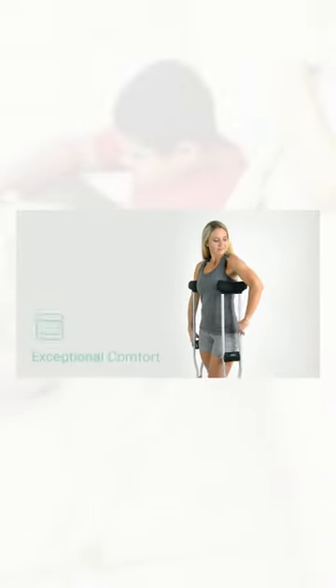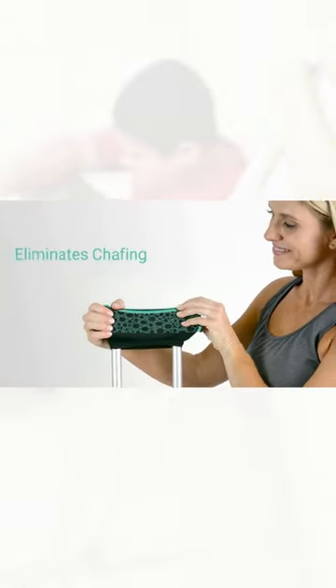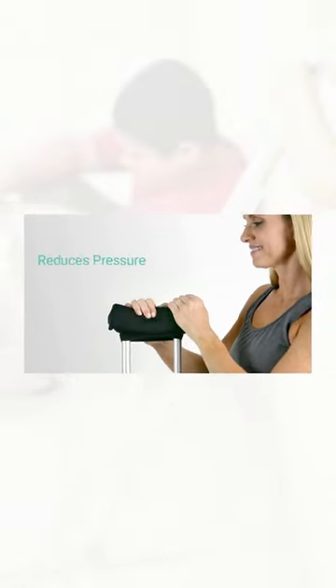The Crutch Pads by Vibe provide exceptional comfort while you're using crutches. The soft, high-density foam padding maintains shape to eliminate chafing and reduce pressure.